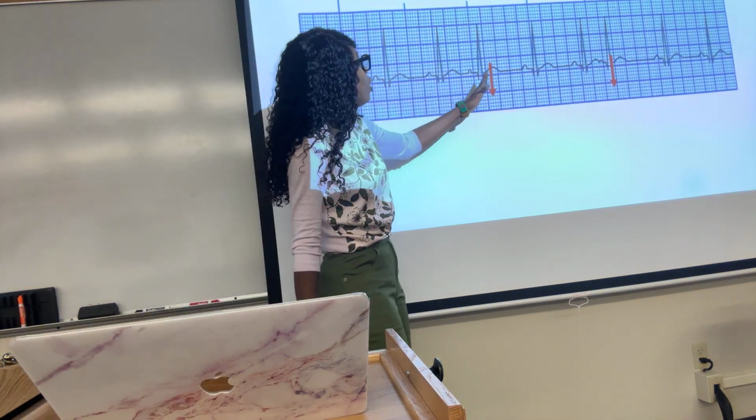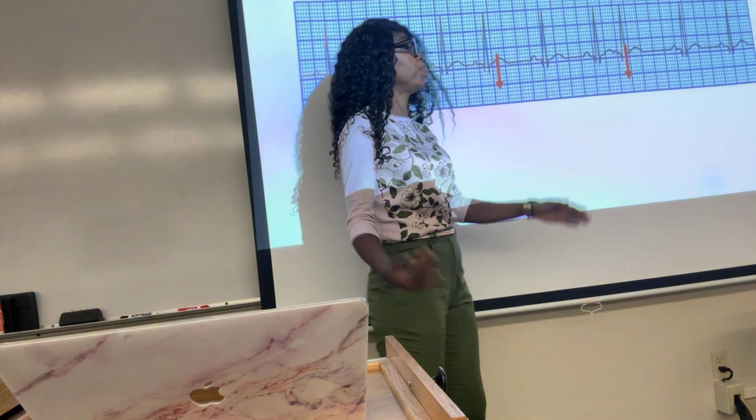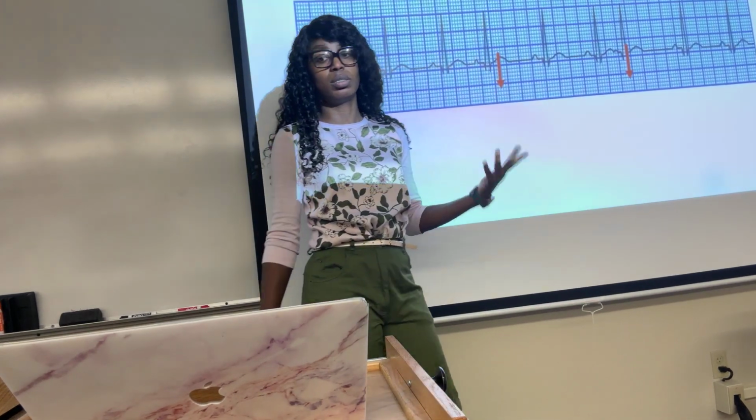Like you see how this happened and then it went back to regular? This happened and then it went back to regular. A run would be, this happens and then right next to it will be another one, and then right next to it will be another one. So that's a run, okay?